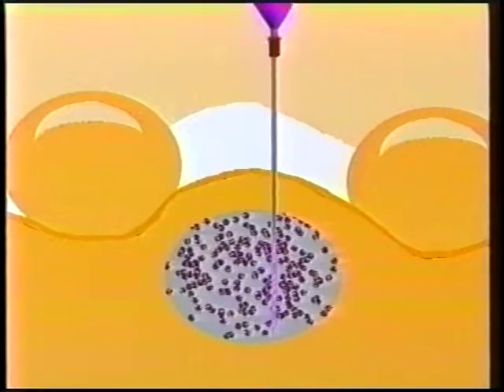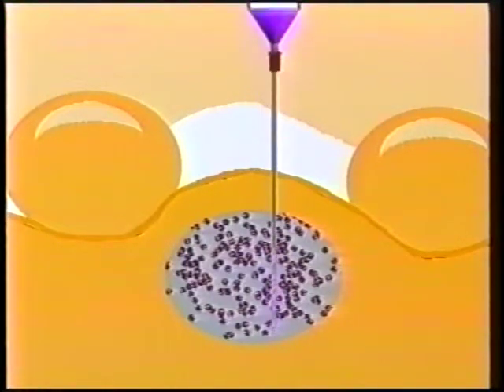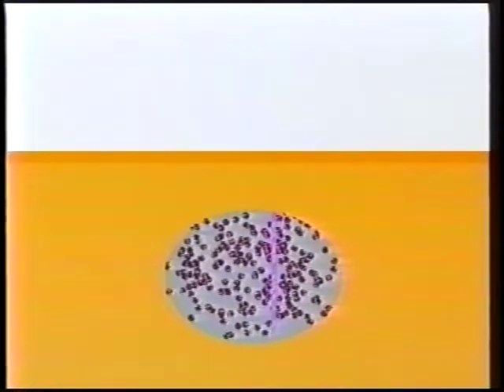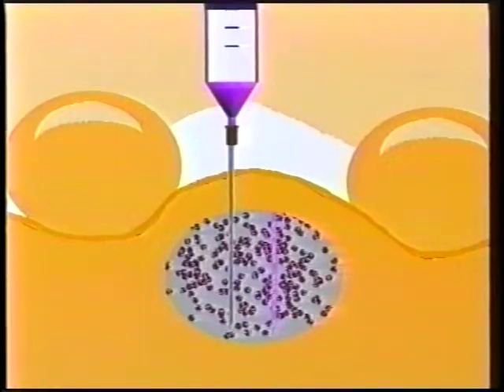In the case of a small target of 1 centimeter or less, there is no reason to consciously redirect the needle in order to sample different parts of the nodule. This is for 2 reasons. First, the needle will naturally travel in slightly different tracks. And second, at least 2 separate samples are routinely taken and will inevitably sample different parts of the target.